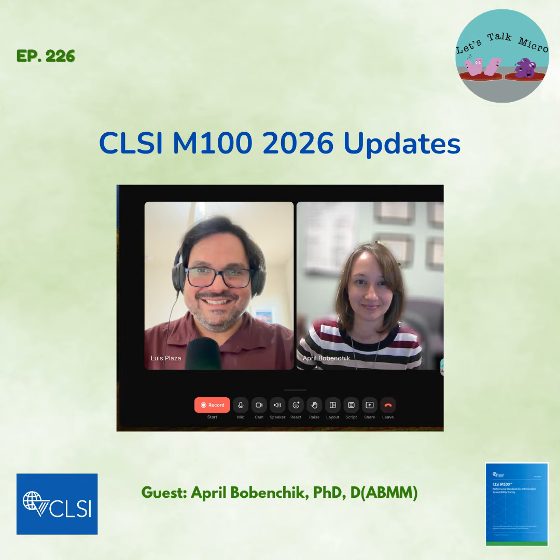Yeah, so we temporarily remove them when we are looking at the data. The original breakpoints were set on the old tobramycin disk diffusion diameters, which correlated to the old tobramycin breakpoint. Once the subcommittee accepted the new breakpoints for the standard disk diffusion and MIC testing, we knew we had to pull out the direct disk data because we hadn't evaluated it with the new breakpoint or the new disk diffusion diameters. When we say temporary, it means that it's on our radar. We're currently reviewing the data, but we only vote twice a year for the following year's document. At that point we didn't know what the breakpoint was, so we couldn't review the data until the breakpoint got approved.